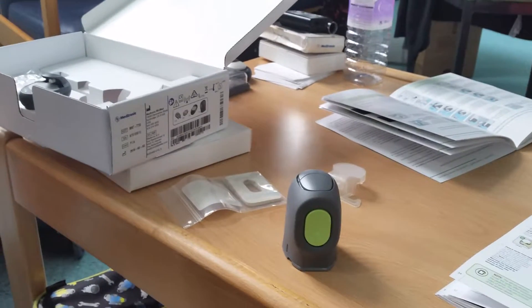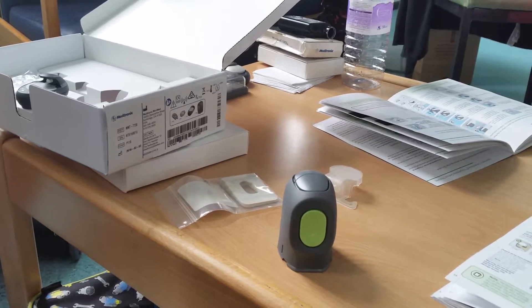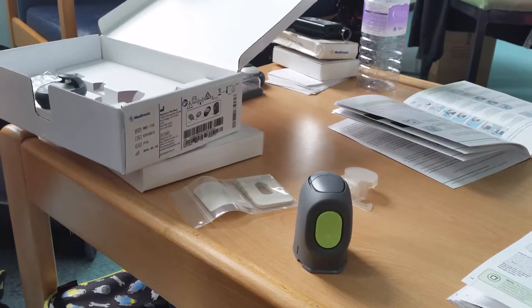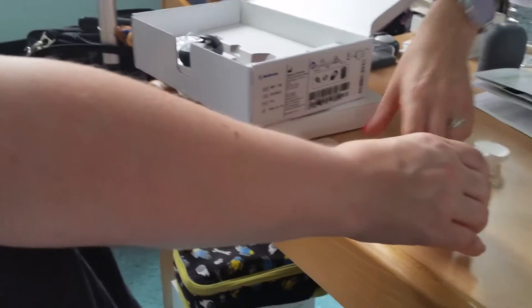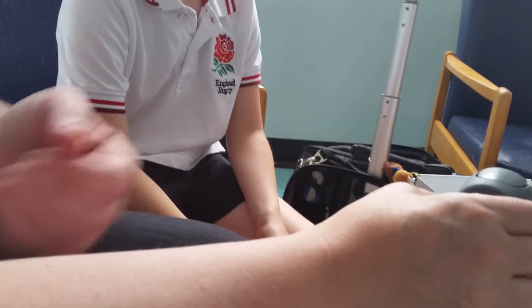Press the tic-tac-y button — press and hold, count to five, then remove. It's probably best if we do this one step at a time, because I want to show you how to place the sensor correctly, because that's very important.